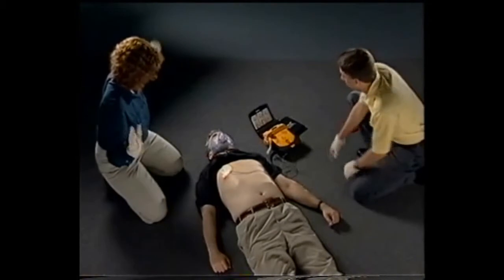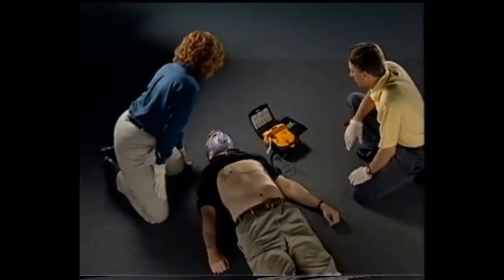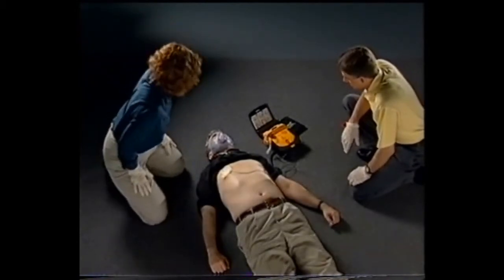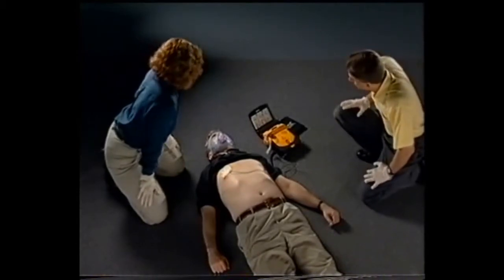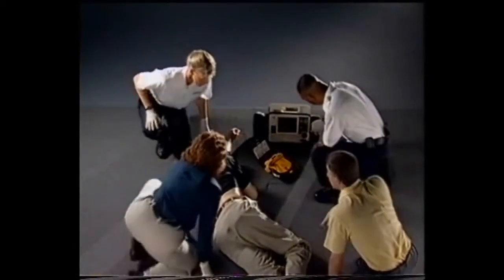The shock is an intense pulse of electrical energy that is delivered to the heart through the pads on the chest. Do not touch patient. The shock interrupts the chaotic rhythm and allows the heart's natural pacemaker to restart effective heart pumping. No shock advised. To survive a cardiac arrest, the person must receive a defibrillation shock as soon as possible, within minutes of collapse.